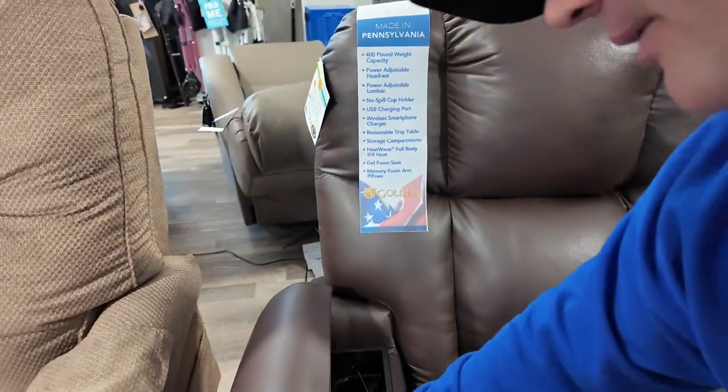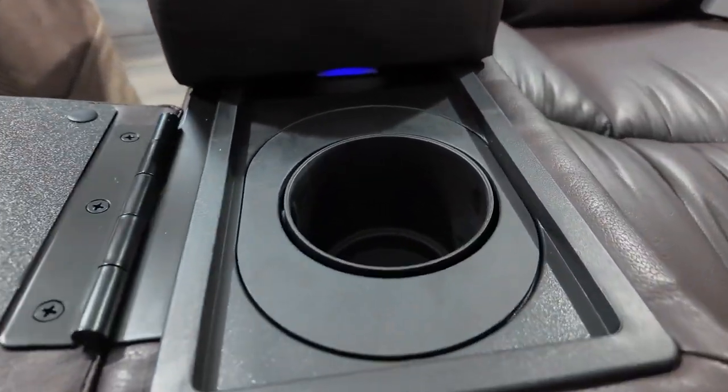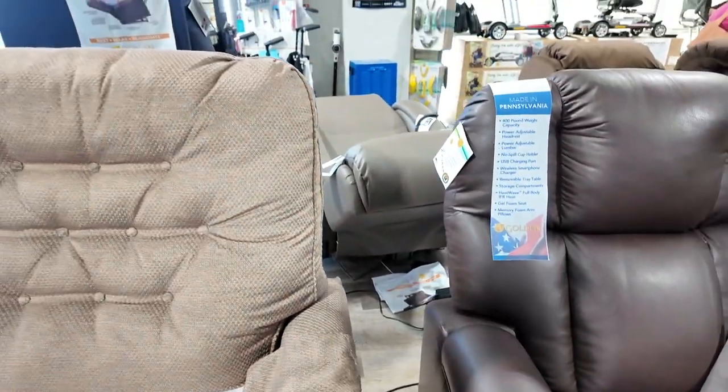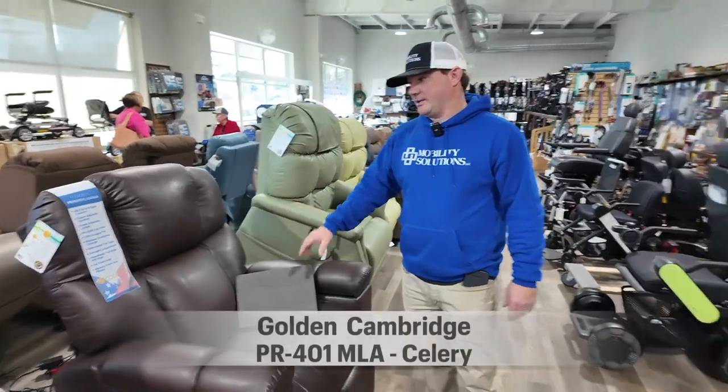What else is nice about this is you have a cup holder. This is displayed in Coffee Bean Brisa, which is a very nice fabric. It's a very nice chair — it holds up to 400 pounds. Really like this chair.